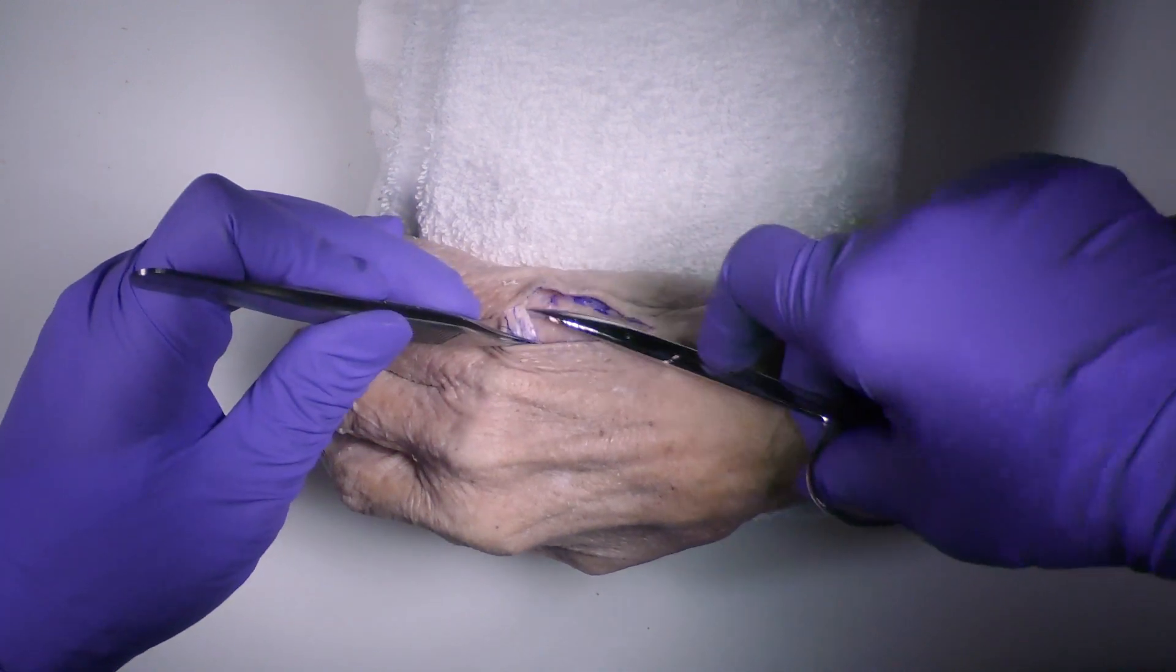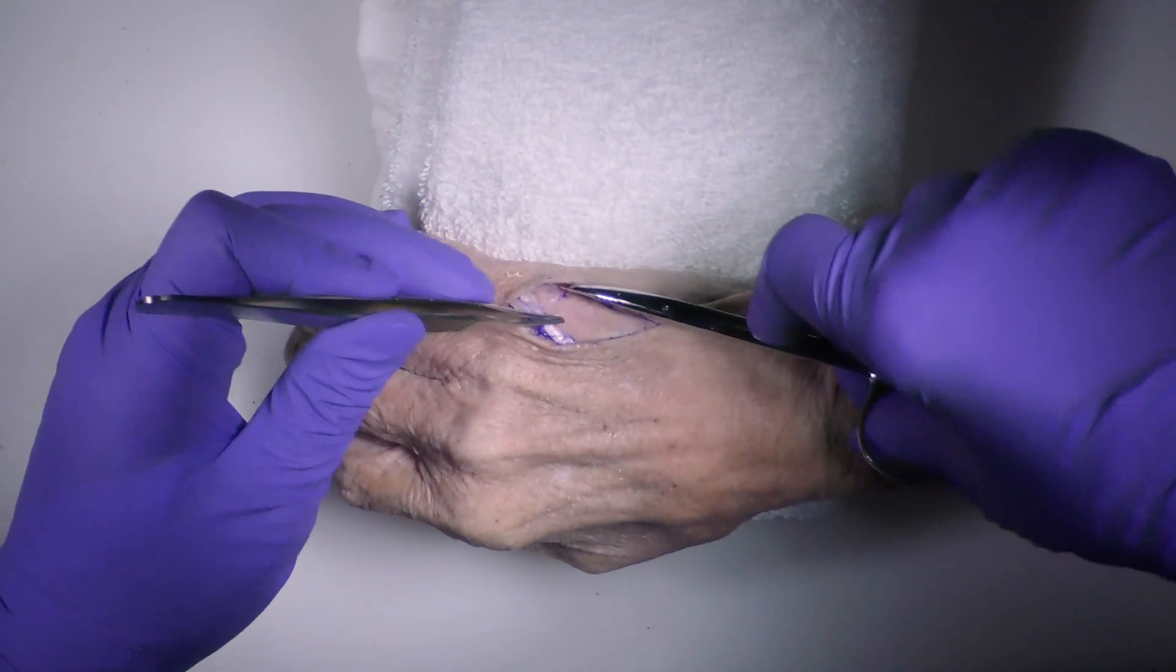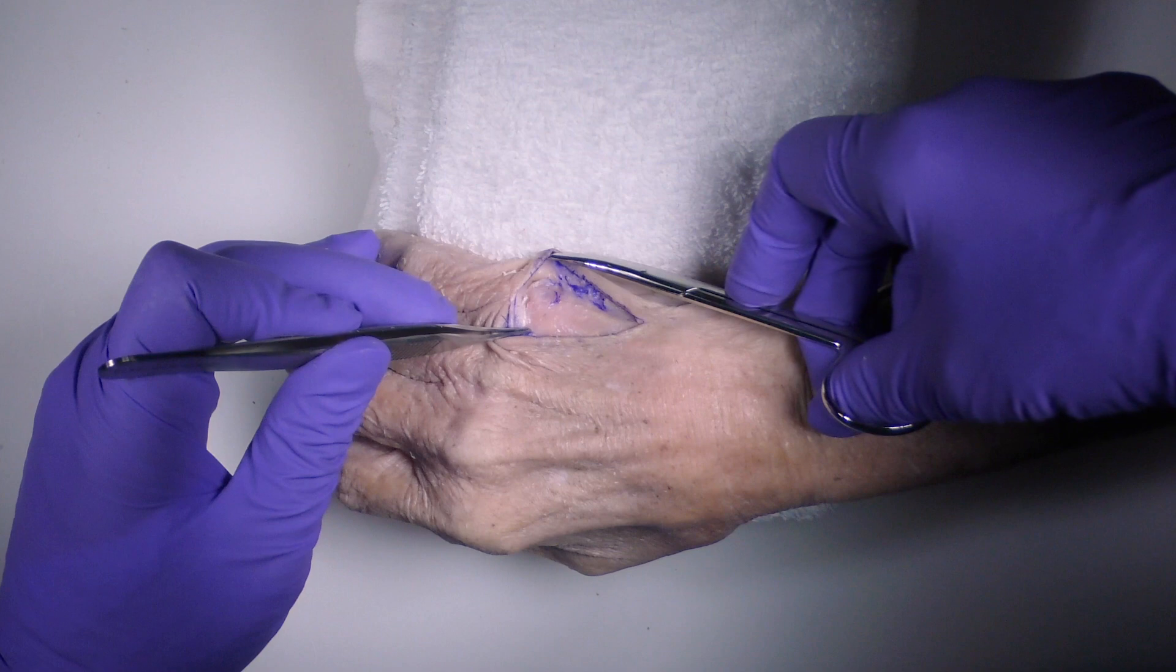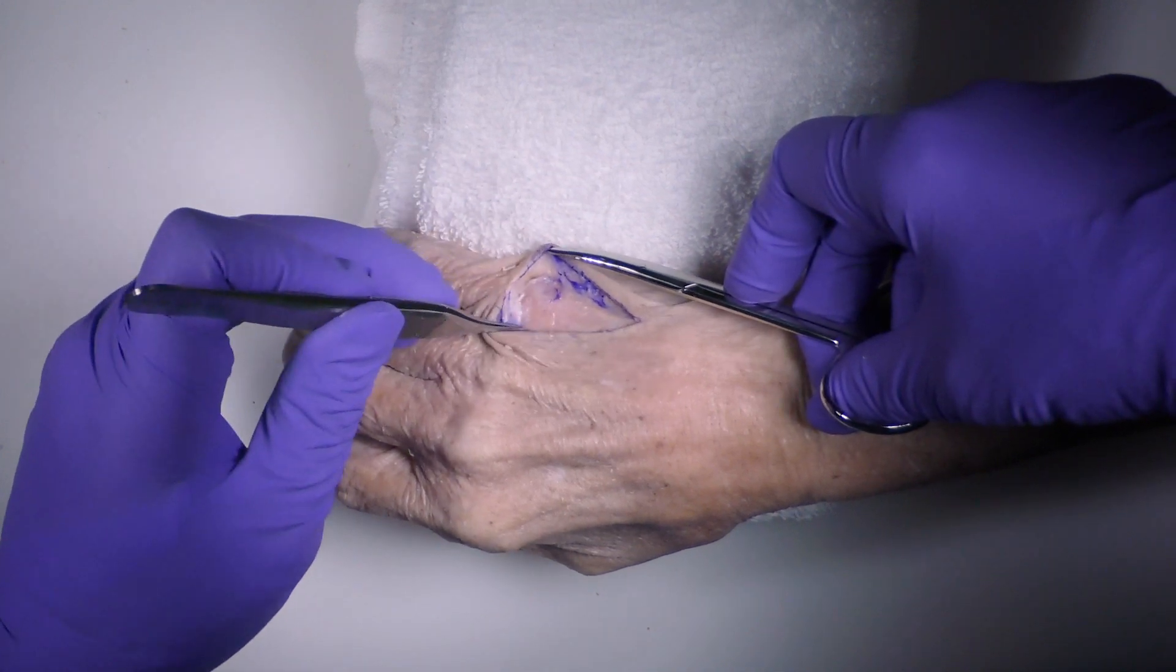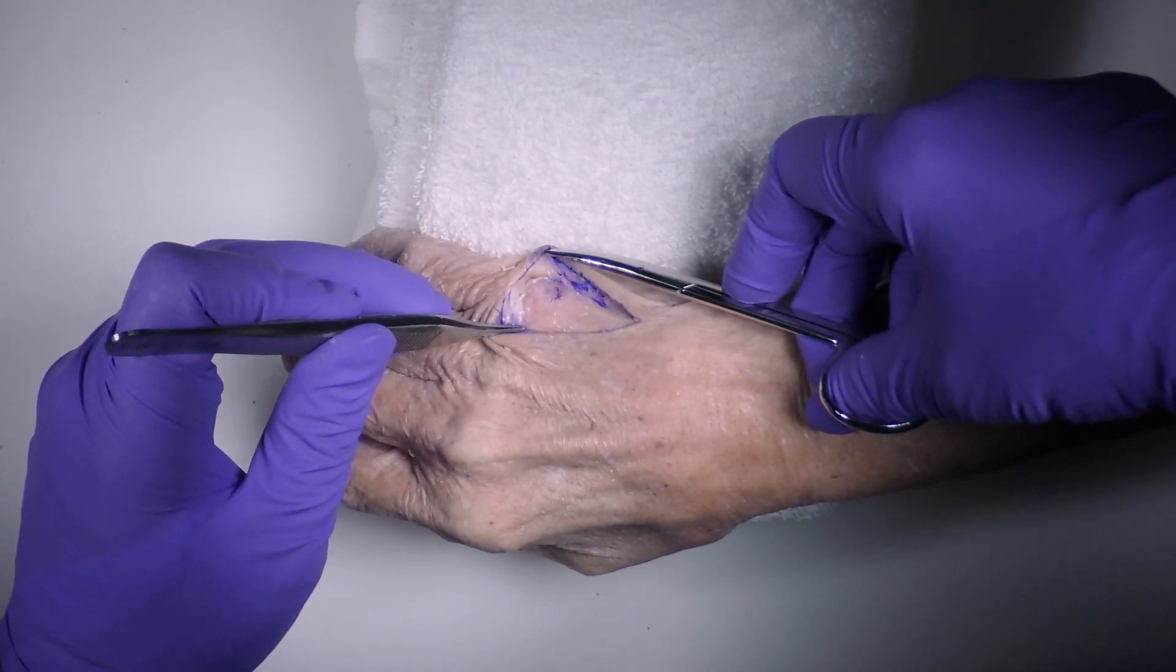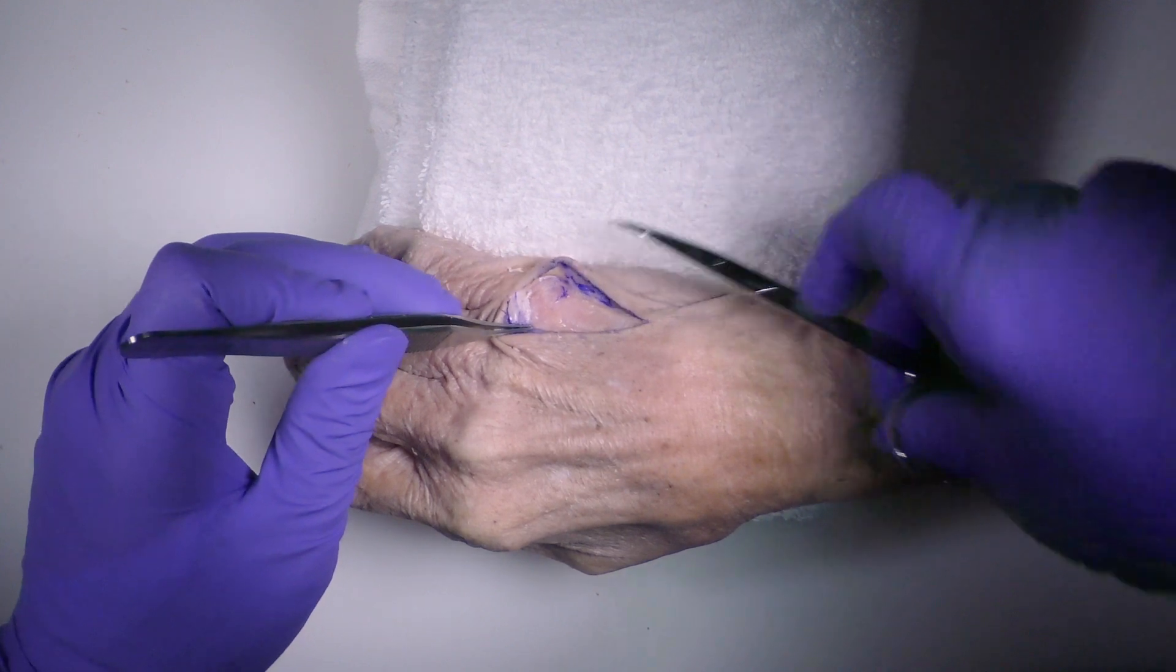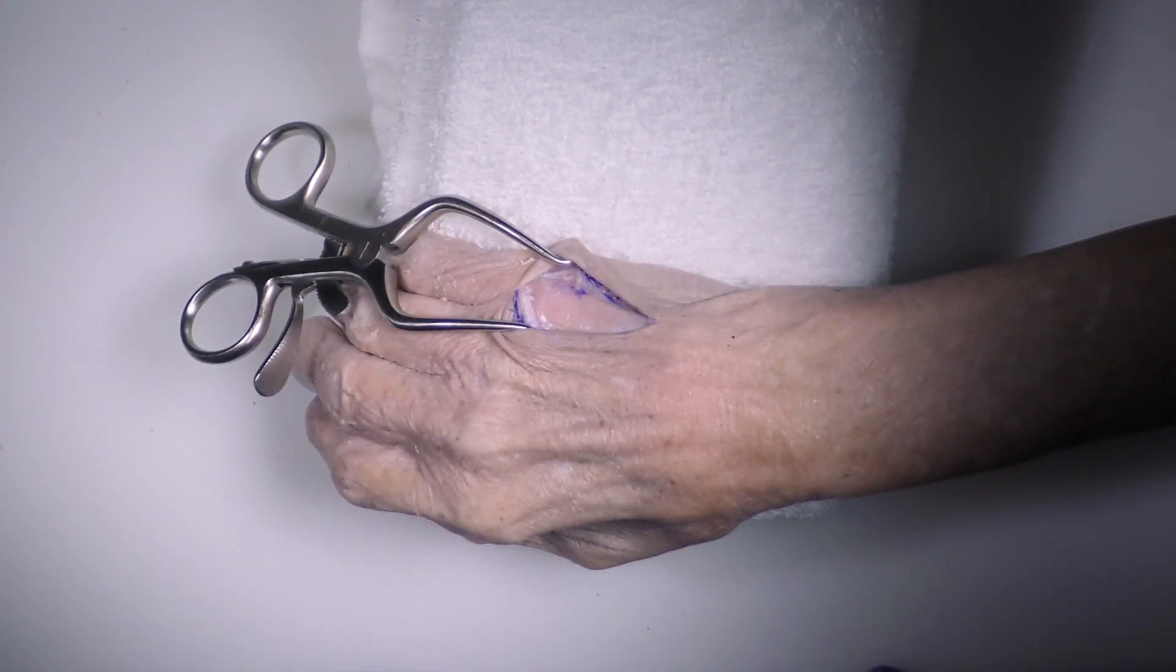So here you'll see we've got our small finger, number five, metacarpal dorsum, of which are very well exposed at this point.